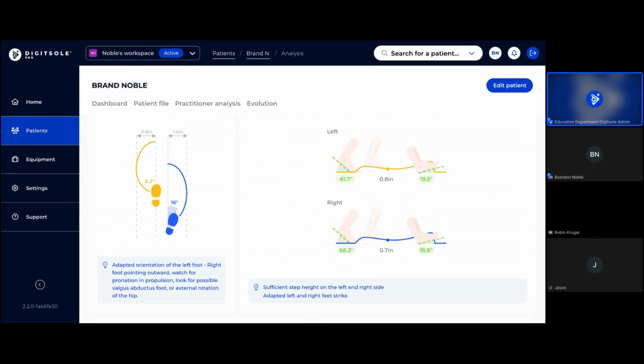Like I said, again, having the background on the patient certainly leads me to evaluate these a little bit differently. A lot of times, Robin, people will send me something with no background data, and I'll just run through potentially every conceivable scenario. But having that history can really help streamline this and help direct where your eyes are going to go.